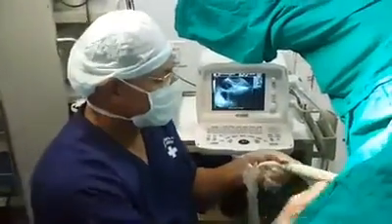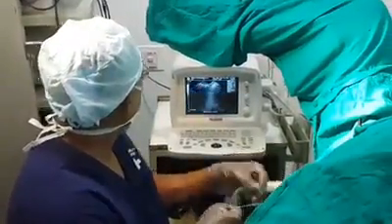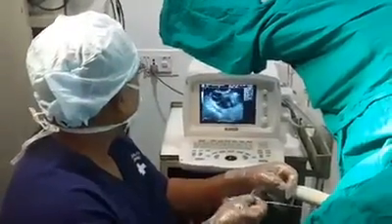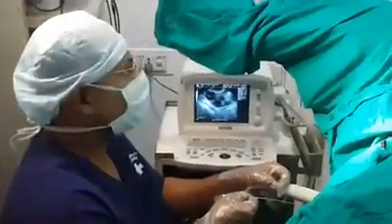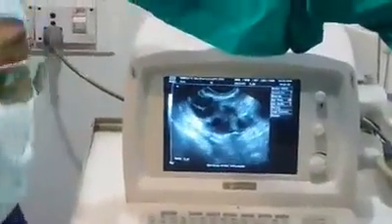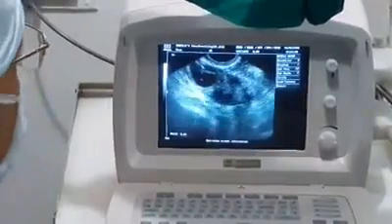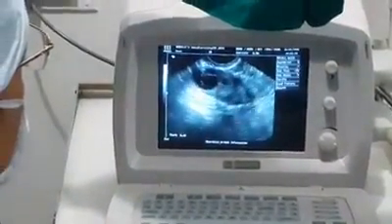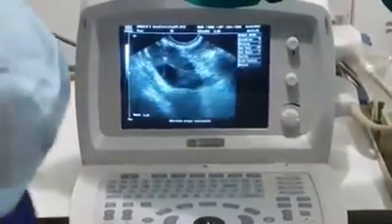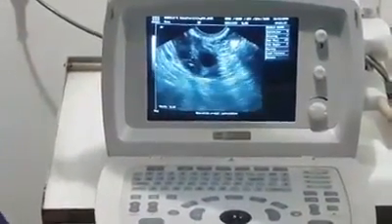I am putting this needle through the needle guide. Now I am focusing on the ovary with the follicle. You can see the line from where the needle will drive. You can see this needle with suction — now you can see it is collapsing. The fluid with the egg is coming. With this method I take out all the follicular fluid and the nurse confirms that the follicle is coming. I am collecting all the follicles.